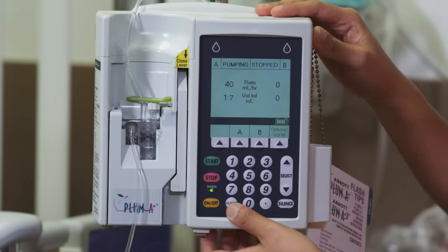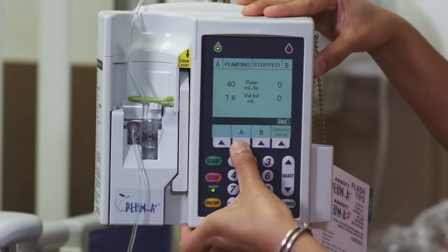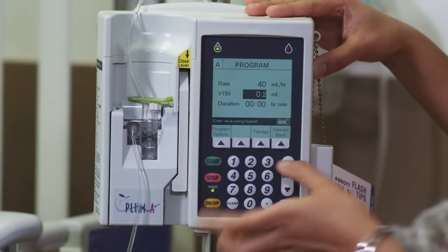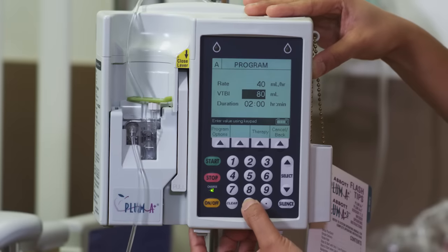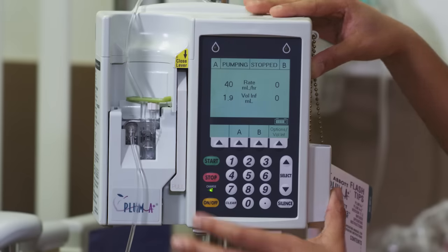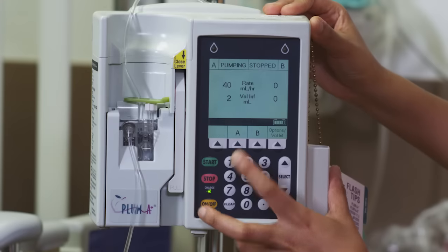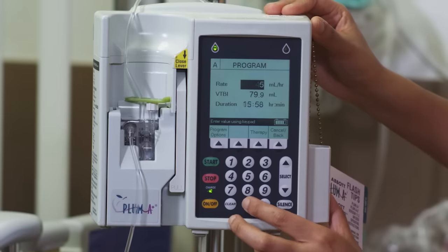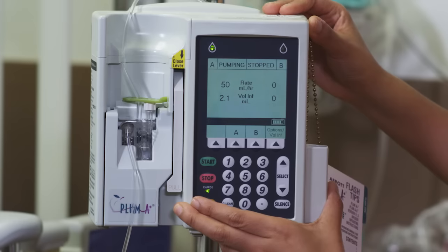For example, if you need to change your volume — say your fluid has all gone in — you'll pick channel A again, go down to volume. It shows 0.2, so we'll change that to another 80 for another two hours. Put that in and click start. Now if we want to change the rate — say we want to change it to 50 — similar to the volume, we'll just change that to 50 and start it again.